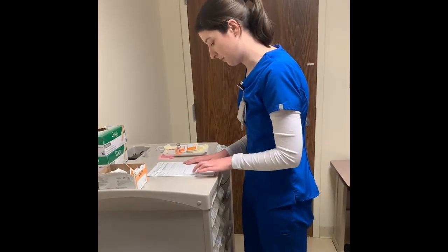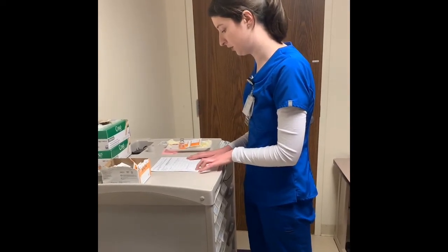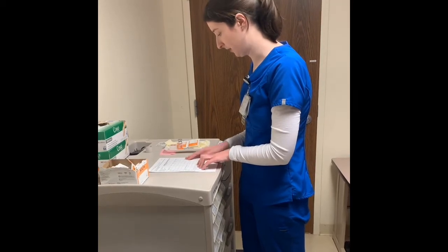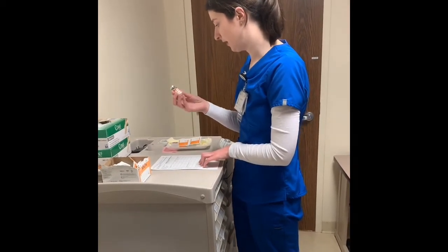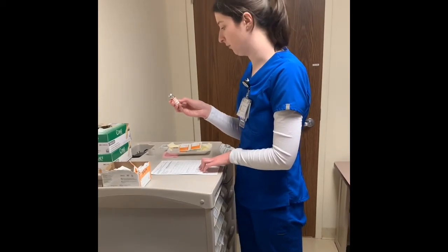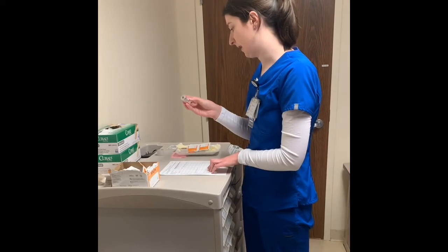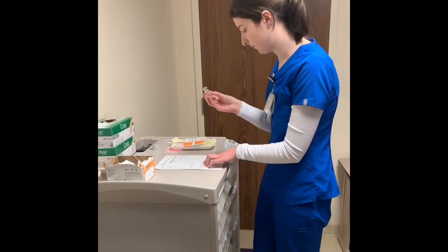Okay. The medication ordered is regular insulin concentrated at 100 units per 1 milliliter to be delivered subcutaneously to the patient. The medication that I have pulled from the drawer is regular insulin concentrated at 100 units per milliliter. Its expiration date is May of 2026, so it is not expired, so it is safe to give.